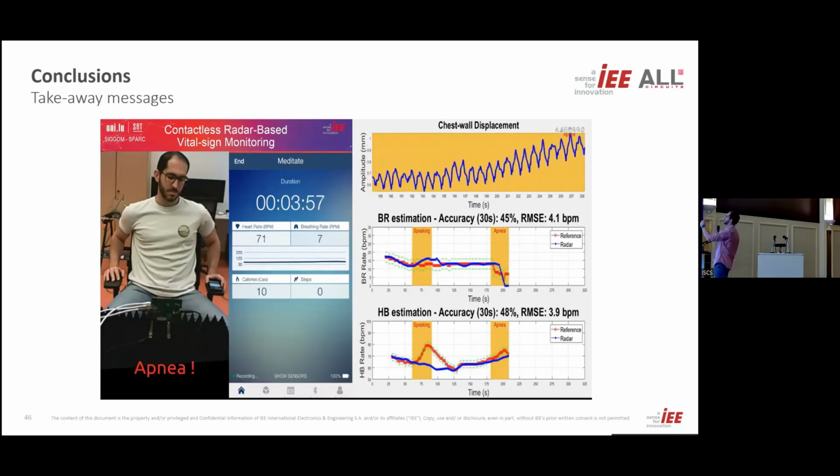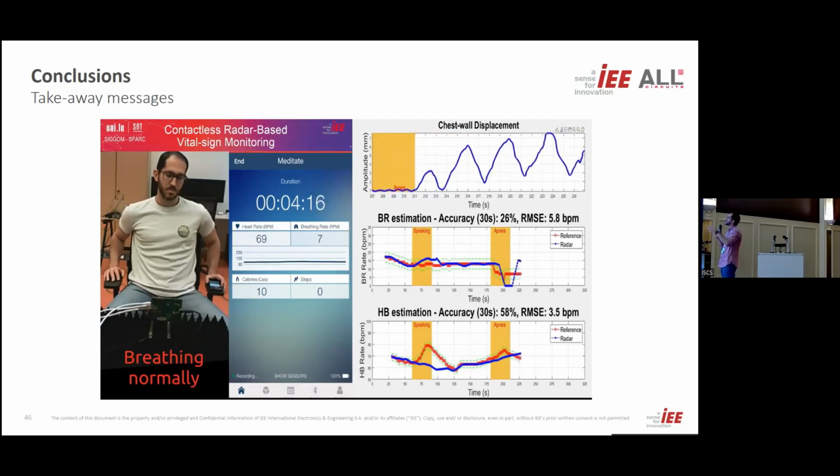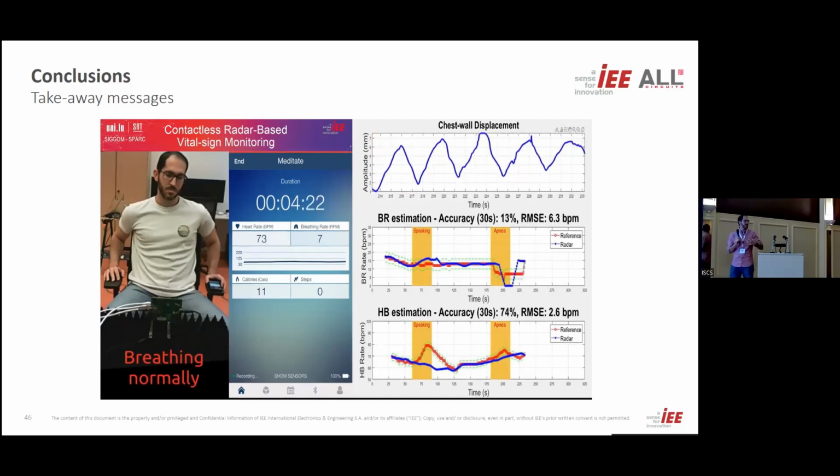So this is the shape of my heartbeat. And then at some point I will come back breathing again. And we can now clearly see the displacement. And it is interesting that we will now get some strange things in the breathing pattern. Some strange shapes appearing, and I believe this is because my heartbeat was beating stronger to recover, and we can see this strange stuff.